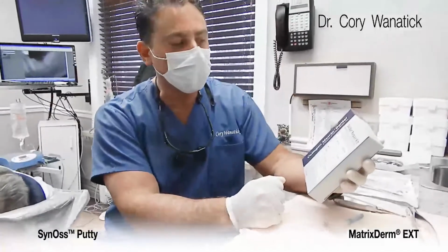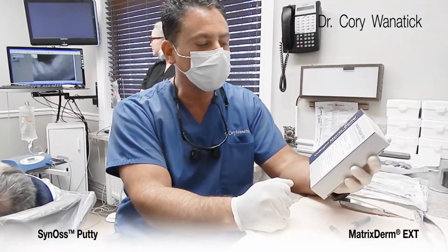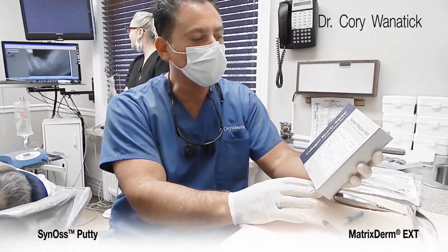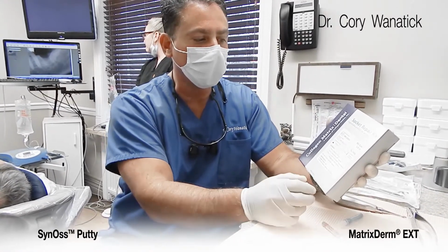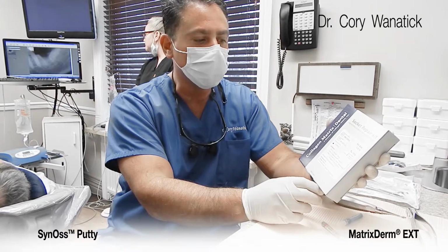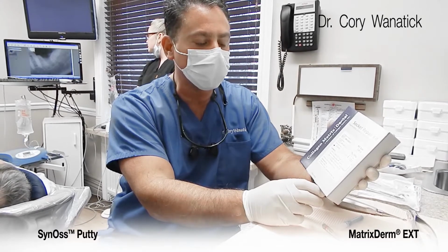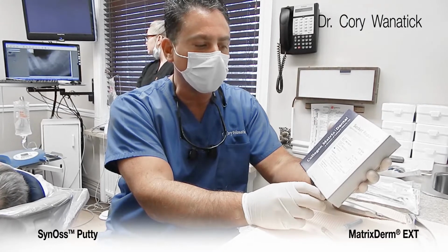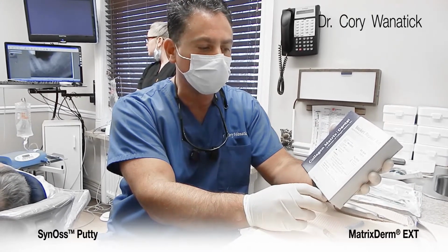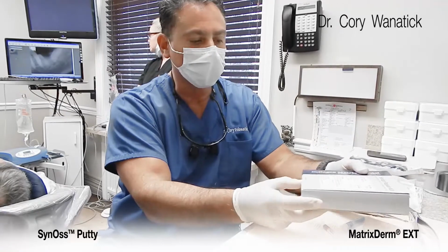We're going to be placing a bone replacement graft on tooth number 18 using the Collagen Matrix Dental Socket Repair Kit. It comes with one Synos putty, one Matrix Derm Extend, which is a porcine collagen, and one polyglycolic acid suture 4.0. Let's open it up.